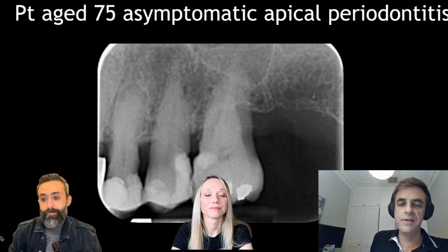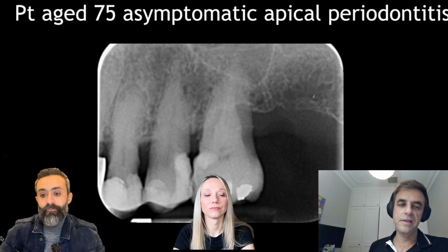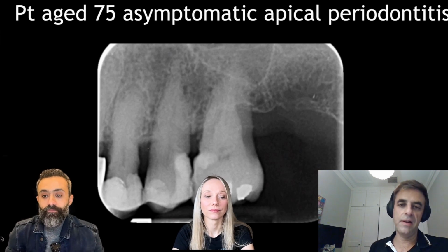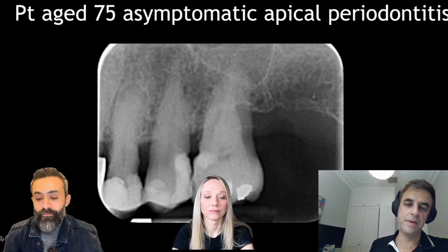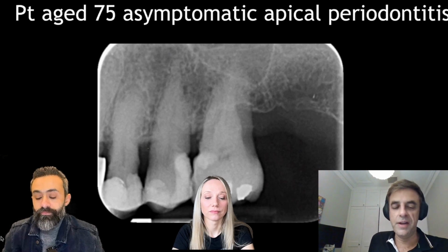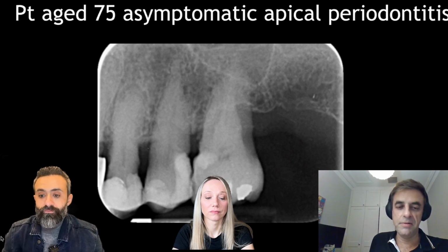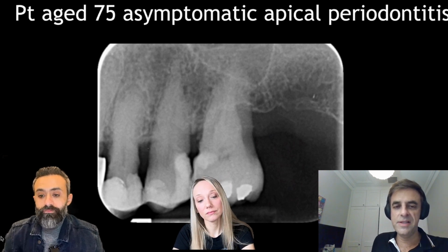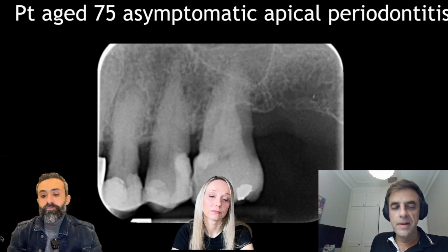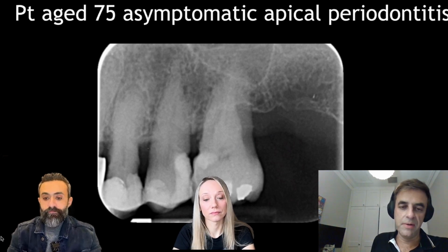Well, that's a very good point. You can see here, this is an interesting one. This patient was a 75-year-old male with asymptomatic apical periodontitis, but an apical lesion. It's tooth 2.5, the upper left second premolar. He's got poor oral hygiene, which obviously needs improvement, and root caries. But we're looking at the upper left second premolar. And so I looked at this tooth and I thought, in a patient like this, there's no reason not to scan the patient and work out what's really going on.